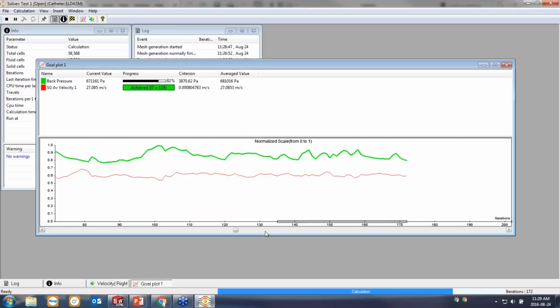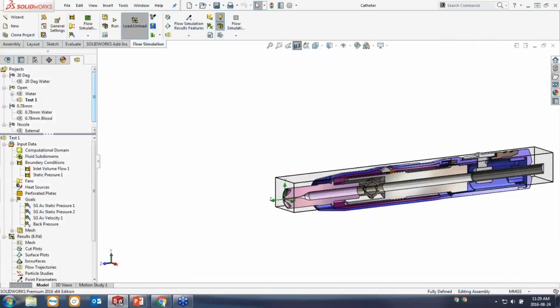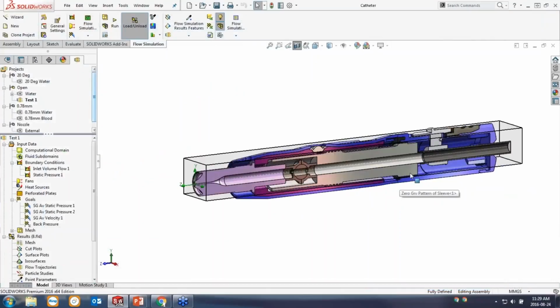And so once that levels out, software is going to say, all right, we're done. We're happy with that value. The solver is finished. I can close this window, and we'll come back to the SOLIDWORKS interface to post-process our results and understand the effects of the simulation.